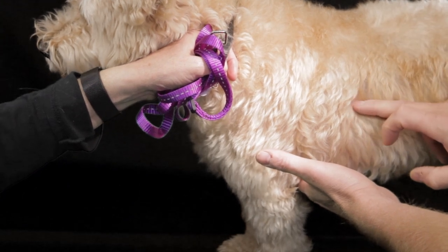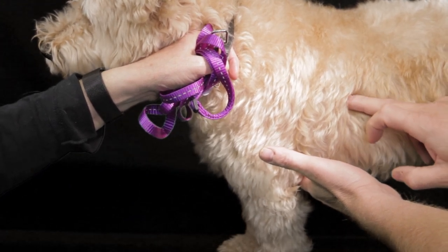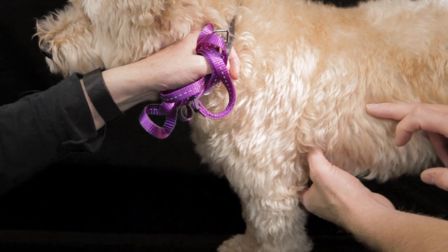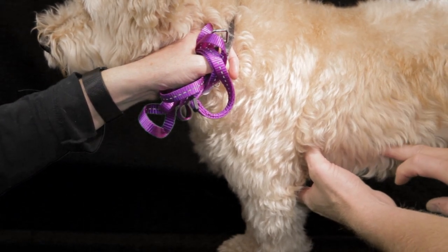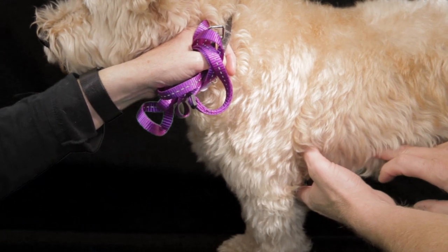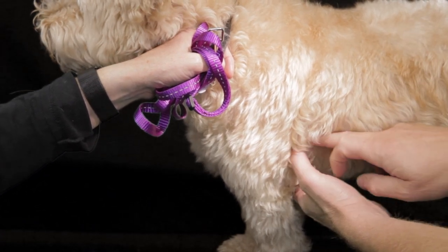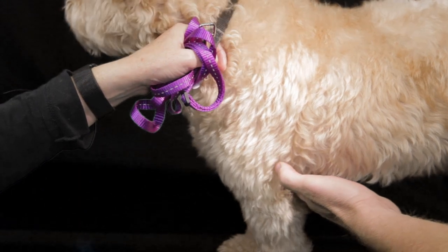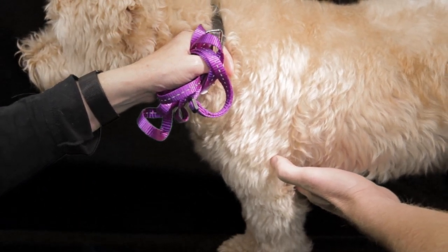We're going to move the probe down to a perihilar region — the middle lung lobe regions — and then look at the region cranial to the heart and the cranial ventral lung regions, and also look caudal at the caudal ventral lung regions. That's four sites we're going to look at on either side of the chest with the Vet BLUE type examination or regional lung scan.